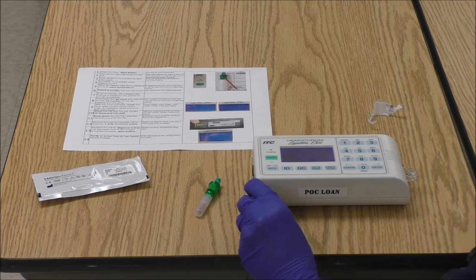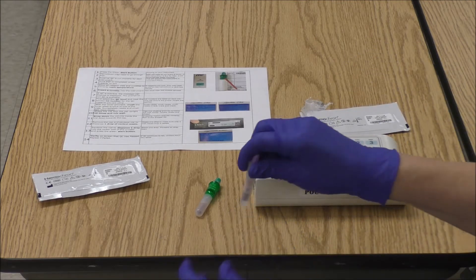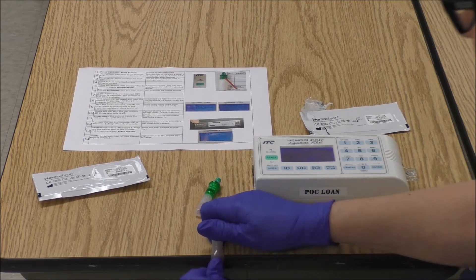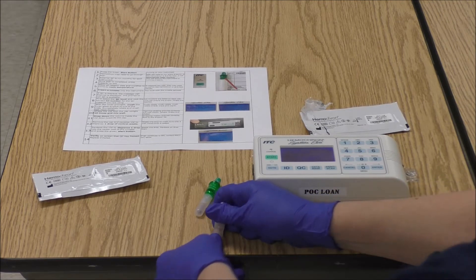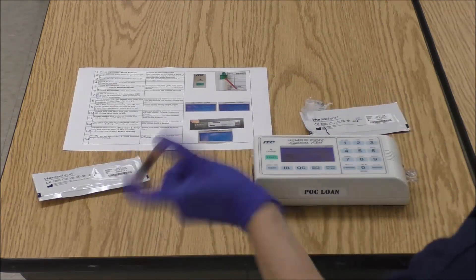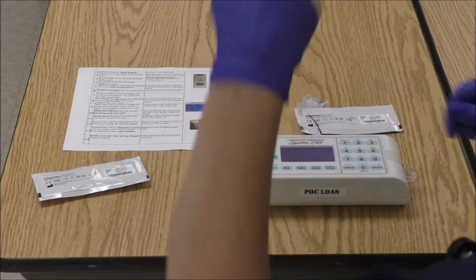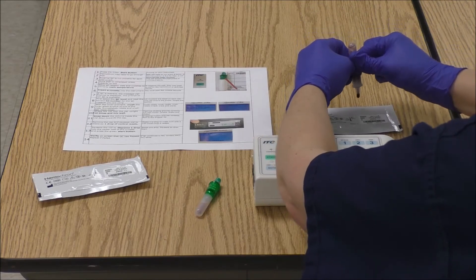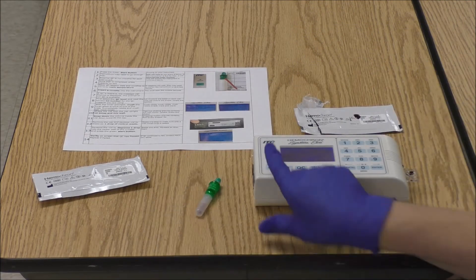Now we're going to add our specimen to the cuvette. Tap down, crack 3 times, rotate, crack 3 times. Shake it — 1 through 10 — shaking it towards the tip so that you can waste a drop, add a drop to that center circle, and then press start.